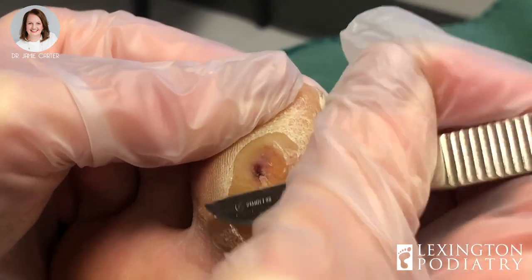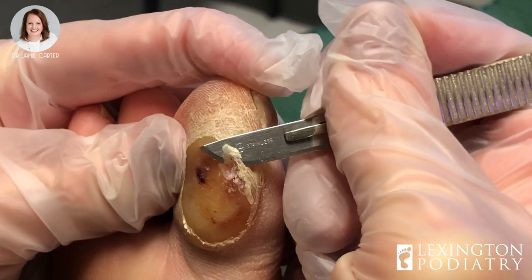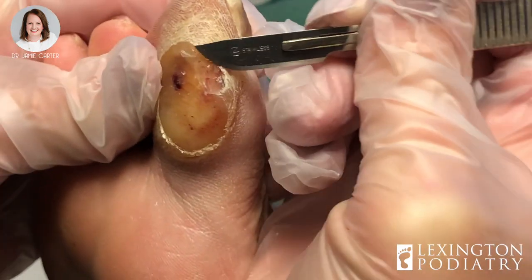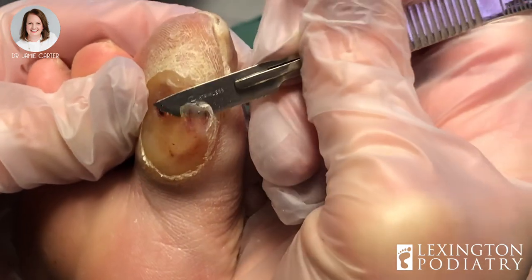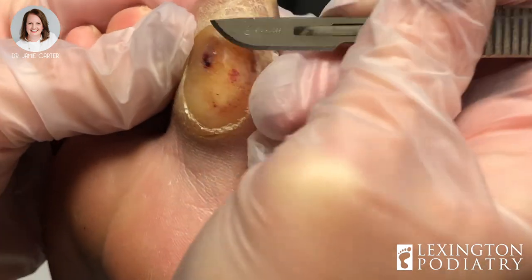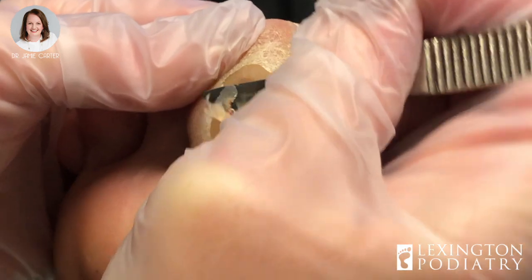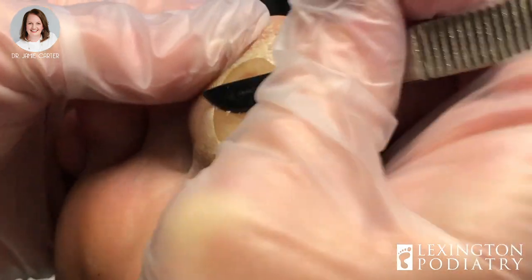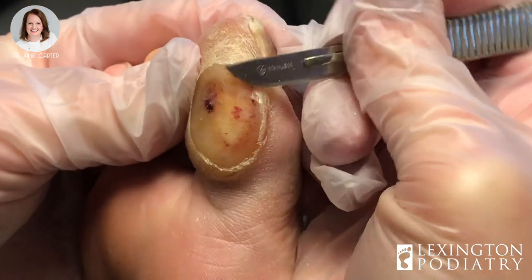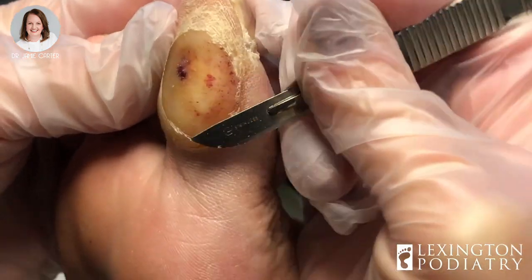As you'll see there's some blood underneath it, and that's just from all the pressure that the callus forms. The thicker it gets, when you put a shoe on it puts more and more pressure on the underlying skin, and that's why it's important to get these things cut off by a podiatrist — because you can develop a wound. If the drainage underneath has nowhere to go because it can't escape outward due to all the callus tissue, it has no choice but to burrow a hole deeper and deeper into your skin.